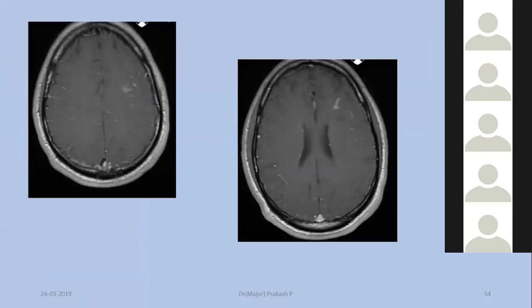Okay, now they have even given a contrast. So how does the contrast change the scenario? In this case, the area which is infarcted, or what we suspected as infarct, shows mild enhancement. Now how will we proceed?